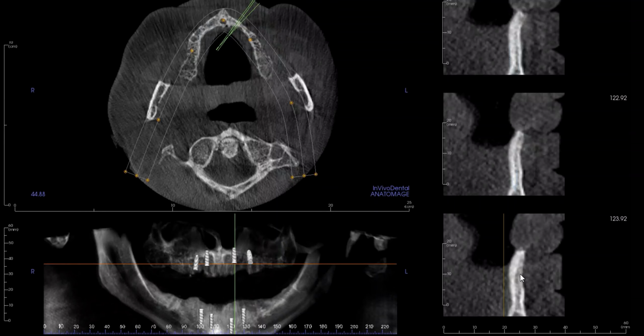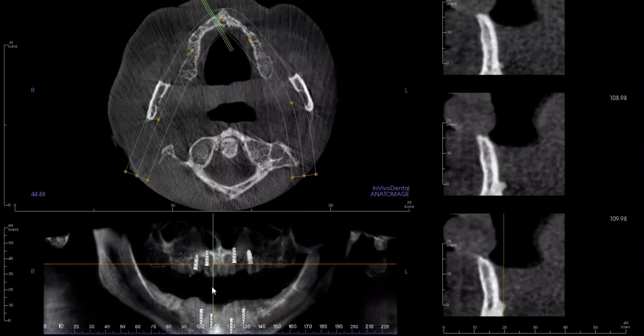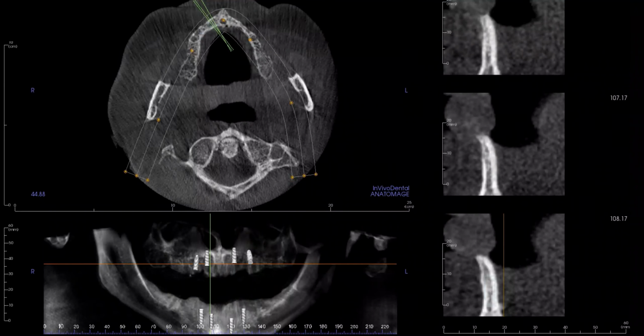of the implant itself. That is one of the reasons why I like the BioHorizons implant, because it is designed for soft tissue adherence. With that said, that's something I want to rely on in a worst case scenario. In situations like this, I don't know what the answer is. The grafting, onlay grafting of some sort to get us where we need to be, not relying on soft tissue adherence to an implant. What is our width here?